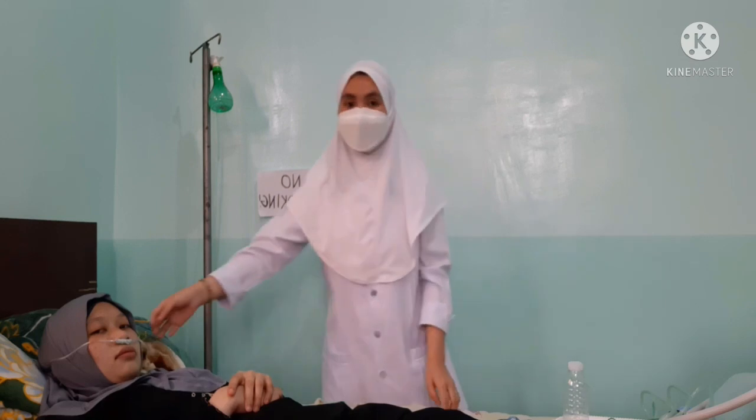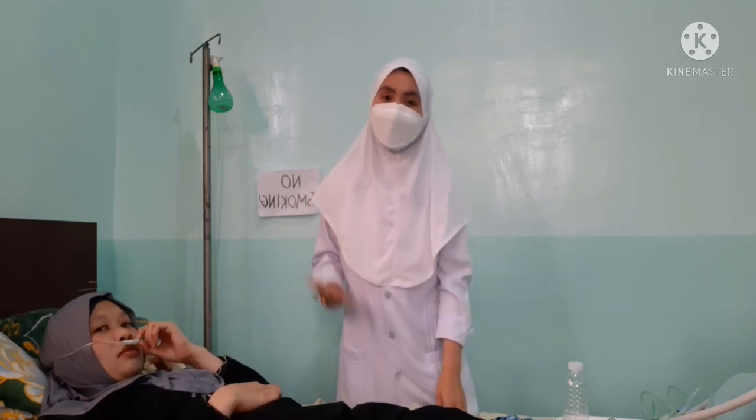Adjust the straps around the ears for a snug, comfortable fit. If the cannula will not stay in place, tape it to the sides of the face. Pad the tubing and band over the ears and cheekbones as needed.